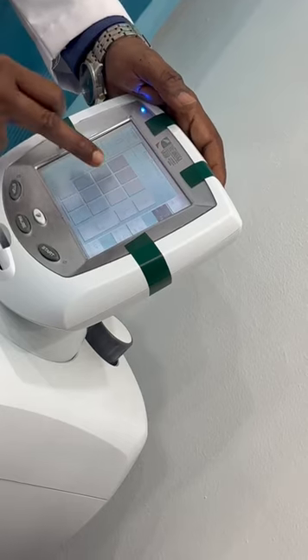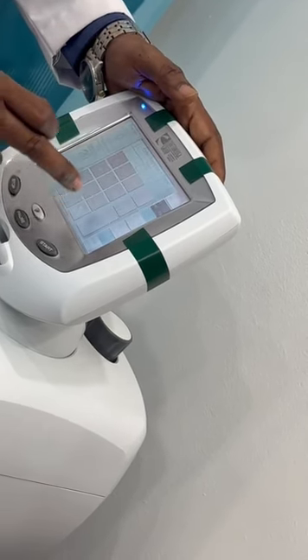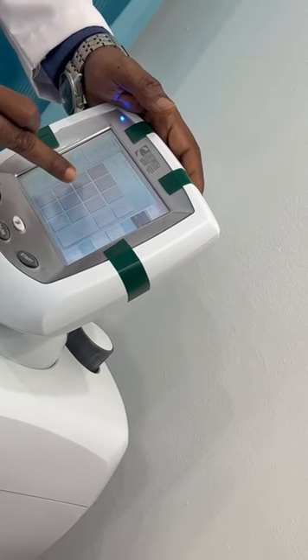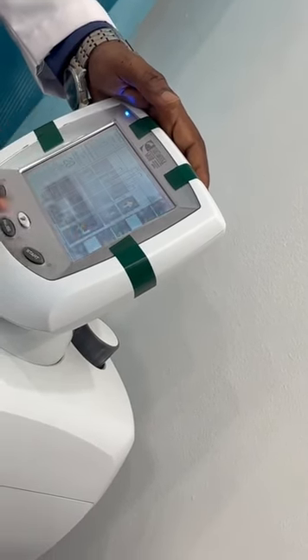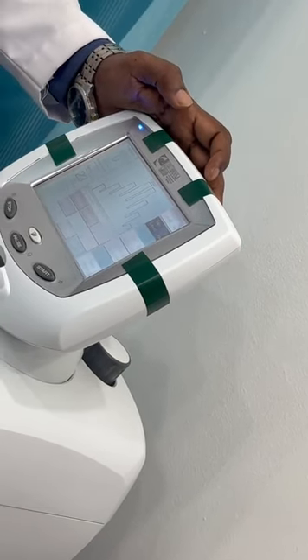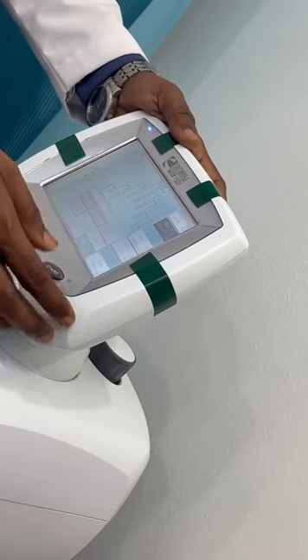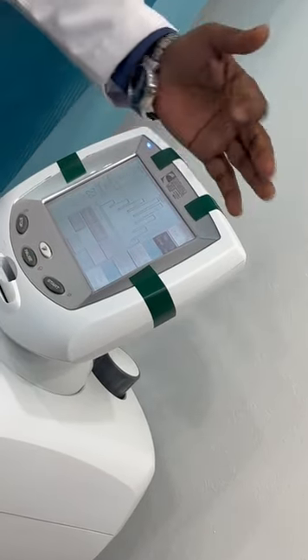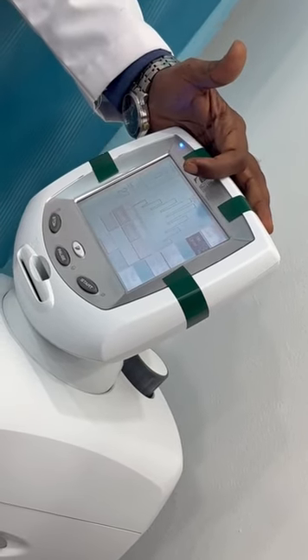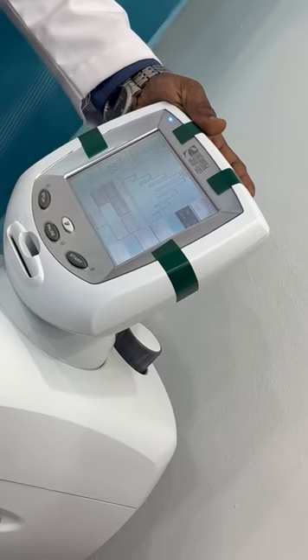Usually we keep some 4 to 6, 4 steps this side and 4 steps. More steps will be more convenient for the patient. So slowly progressing and slowly lowering the resistance. What is the maximum number of steps we can keep? Usually we'll keep 6. By default 6 steps will come, but if you want to reduce this, you can.